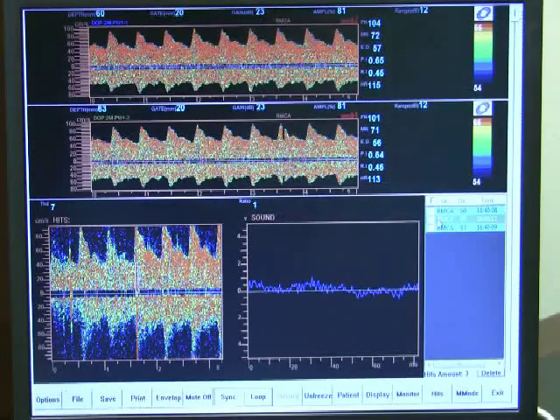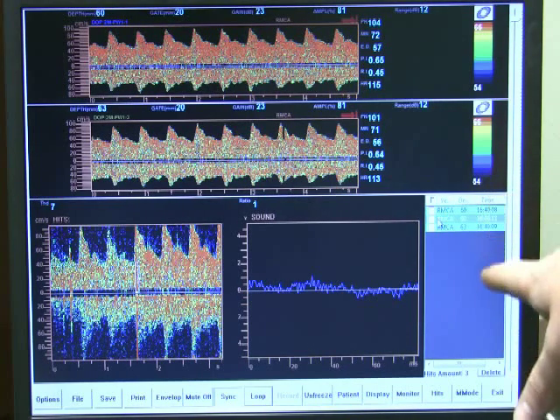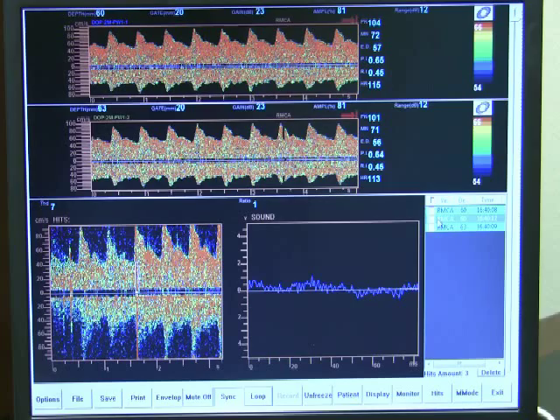This would be for PFO studies, for stenting, where the physician may not be in front of the computer, in front of the machine, and he can review this in a timely manner by selecting the hits that are saved and then determining if they're emboli, artifact, particle, air, etc.